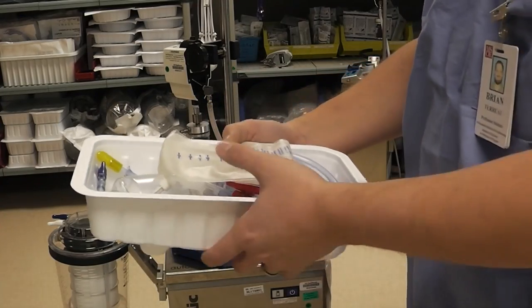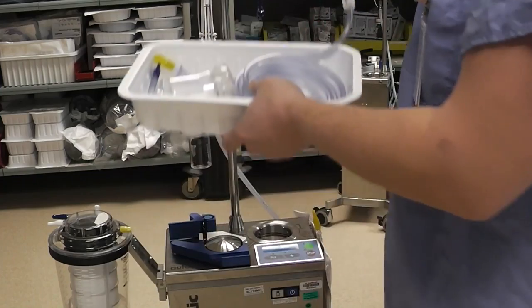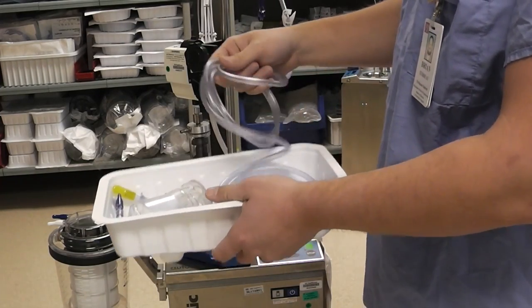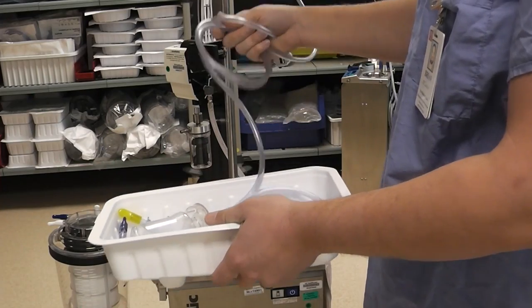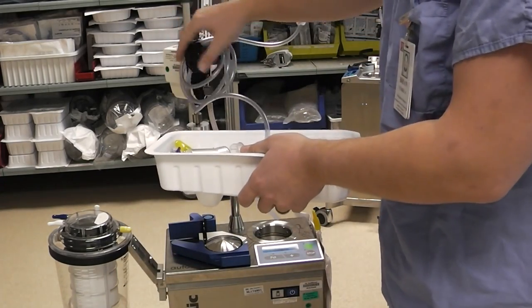Next we can carefully remove the rest of the contents of the wash kit. We can take the collection bag and hang it from the hanger on the top of the cell saver and remove these lines, keeping them coiled and organized. I like to just hang them off of this knob.